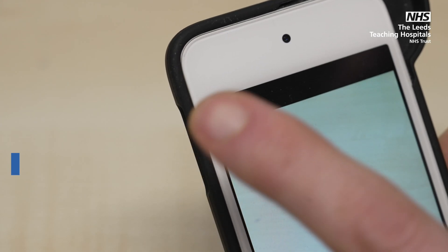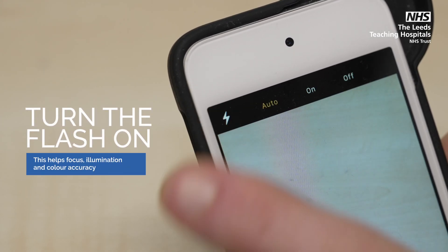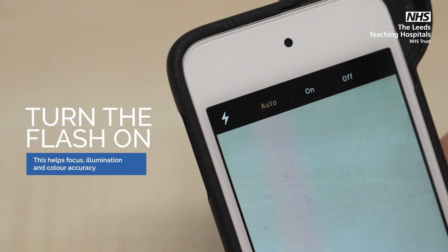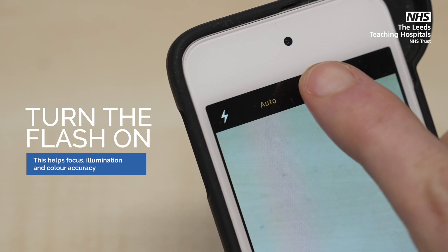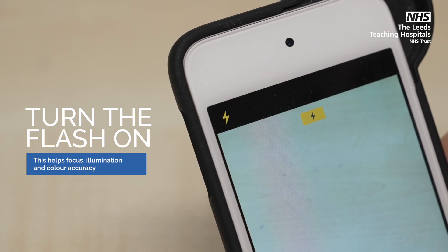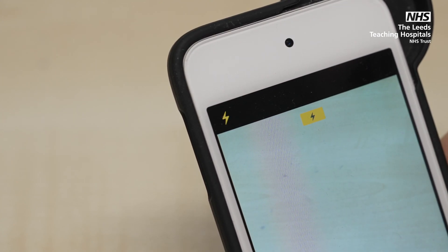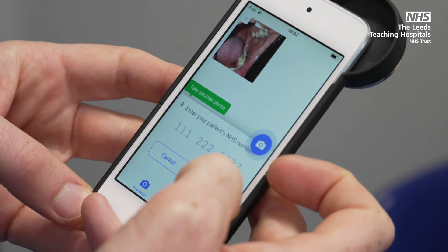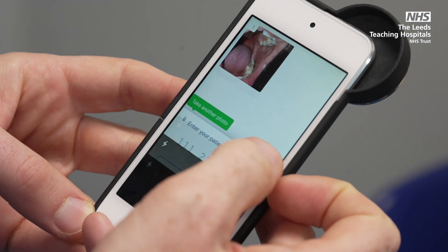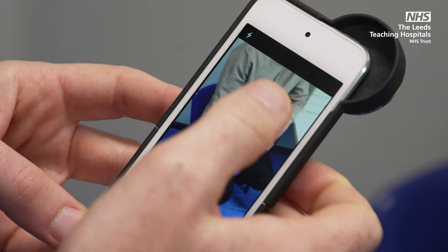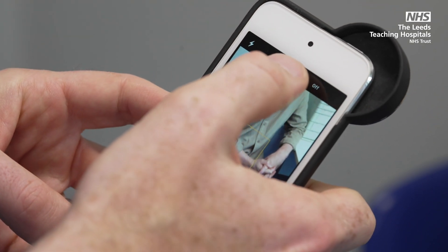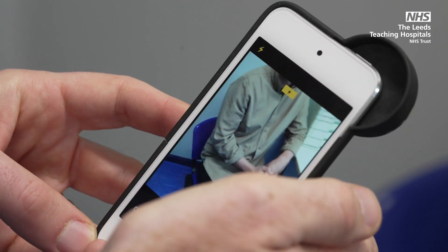Turn the flash on. This helps to focus, provide illumination, and assists in gaining colour accuracy. If you are taking more than one image, be aware that you may need to turn the flash on each time.